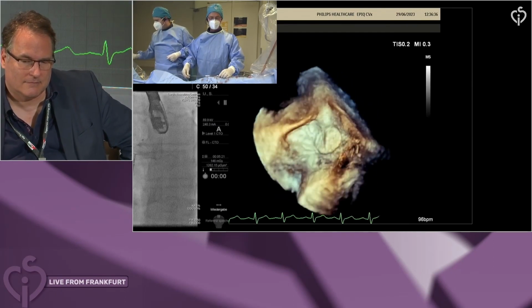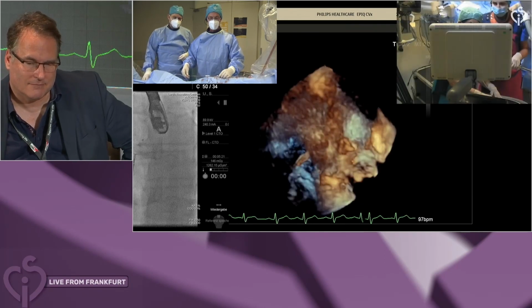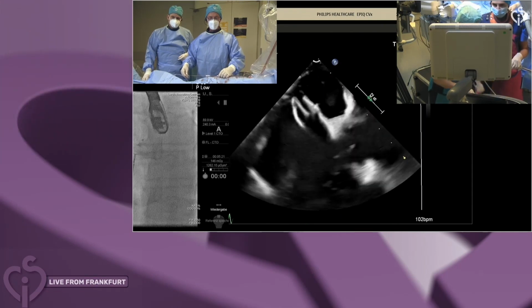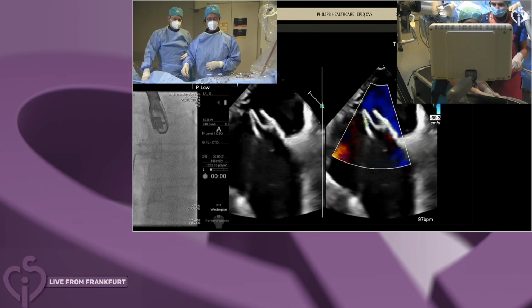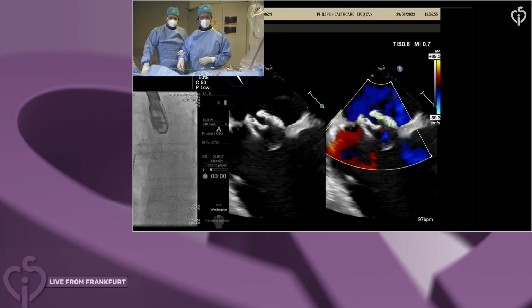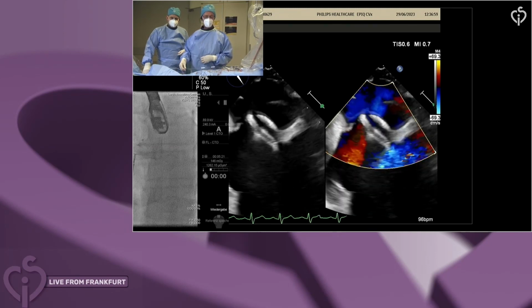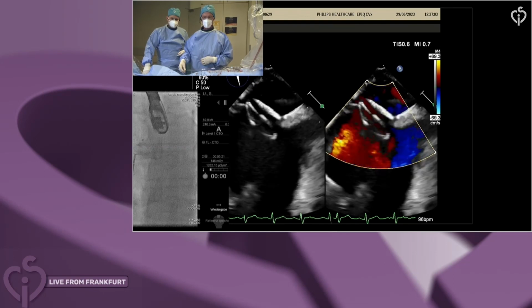So just really quickly, looking on the echo, it all looks nice. Everything's captured correctly. We can just quickly go around the discs with a bit of color if you want us to. So here the capture on the aortic rim seems really very short with the left disc, no? Yeah, but I think there's tension from the cable in this secundum septum. It's not a Trevisio cable, so I think there's a bit of tension, and this is why it aligns so nicely.